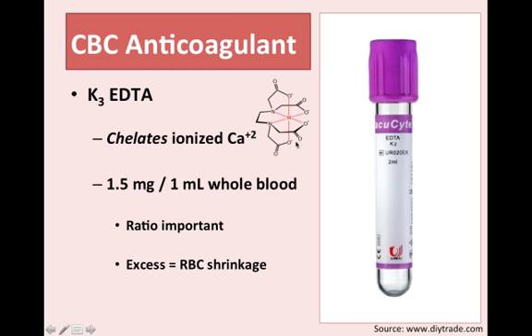This picture here kind of shows what happens in chelation. Basically, chelation is when you bind up a molecule and make it inert. So imagine that this would be the little calcium molecule right here being chelated by the tripotassium ethylene diamine tetraacetate. That's what that EDTA stands for. So pretty lengthy. As long as you know potassium EDTA, I will be happy. This is what it does.